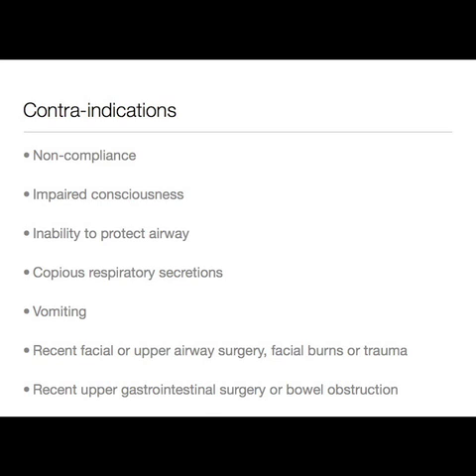NIV is not suitable for use if the patient has impaired conscious level and is unable to protect their airway, i.e., they have an unsafe swallow and a poor cough reflex. NIV is unsafe here as the patient may develop an aspiration pneumonia. Copious secretions, vomiting, hemodynamic instability, and severe hypoxemia for similar reasons are also contraindicated.